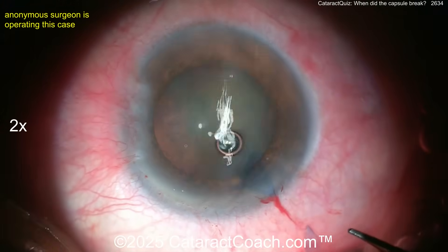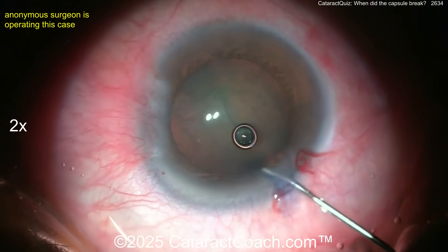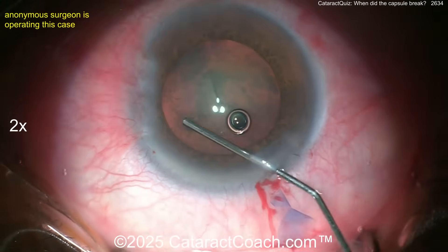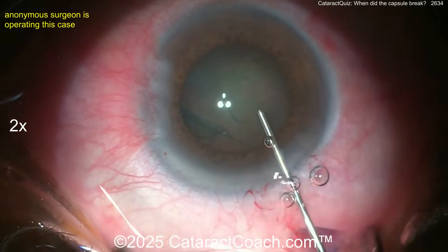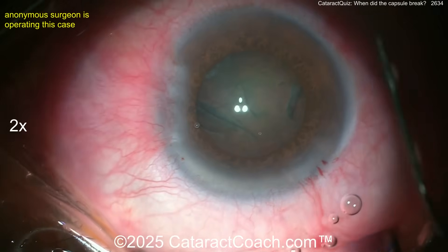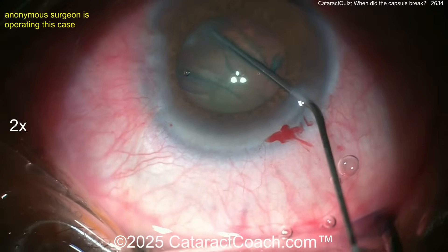All looks pretty good. Here comes some hydrodissection — looks like a 27-gauge blunt cannula. Let's see the fluid wave go across. That was a snap sign. Did you see that? You better rewind the video — that was the snap sign.